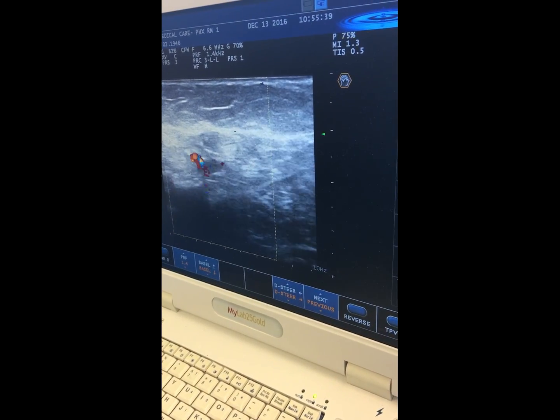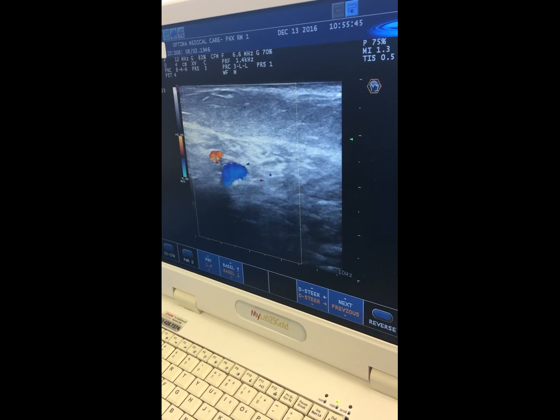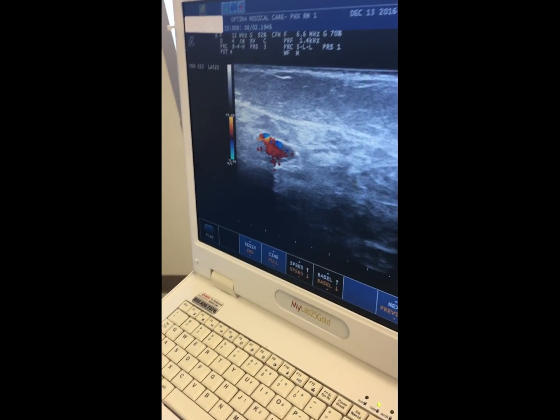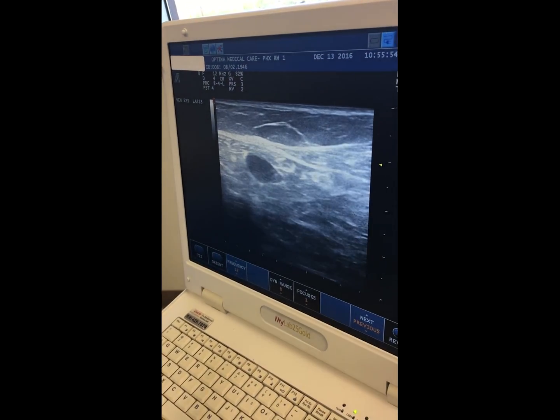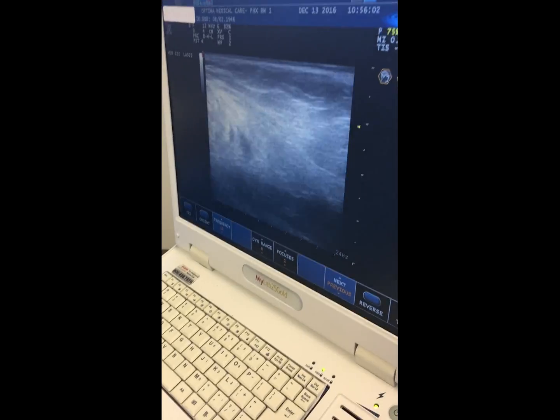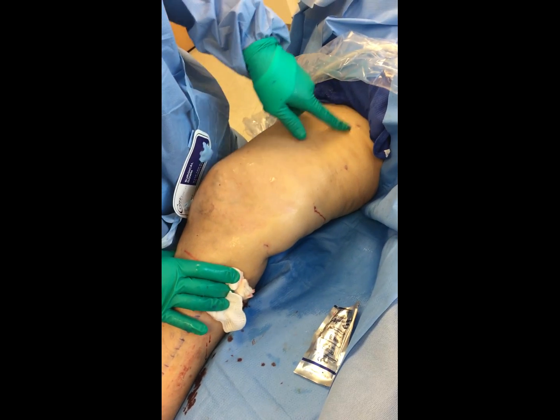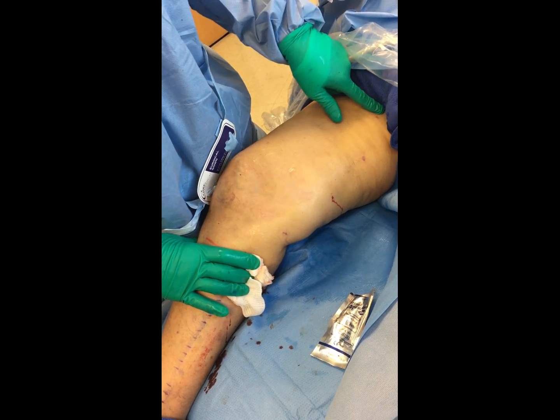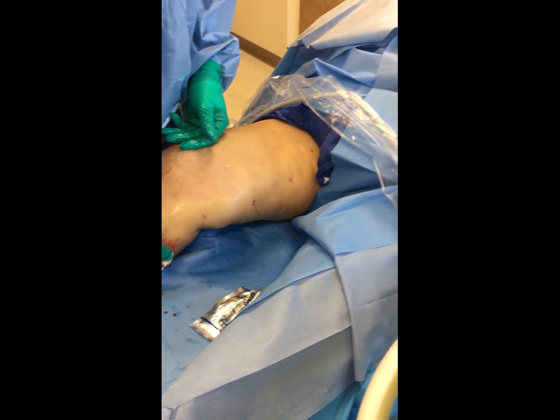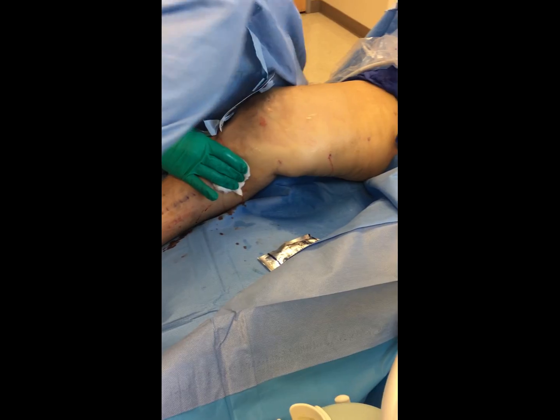This is where her great saphenous vein went into her deep system. We're going to check with a little bit of color to verify that we didn't cause any injury to the deep system. As I go back on the vein, you'll see the vein basically just disappear right about there. The patient is going to leave here with some steri-strips — there are no stitches or anything — and we'll put a few steri-strips down here.